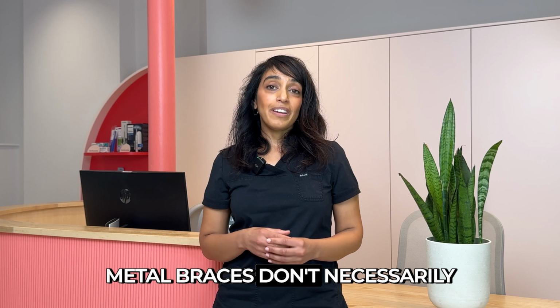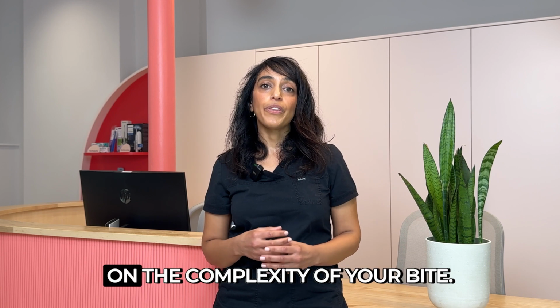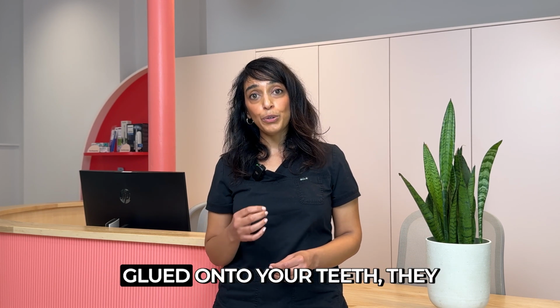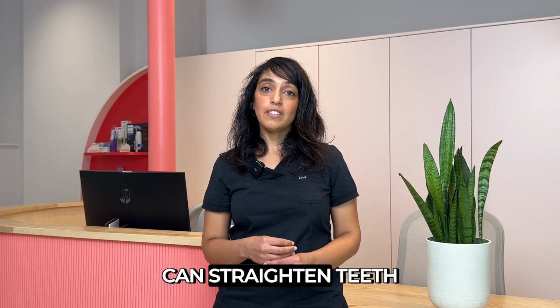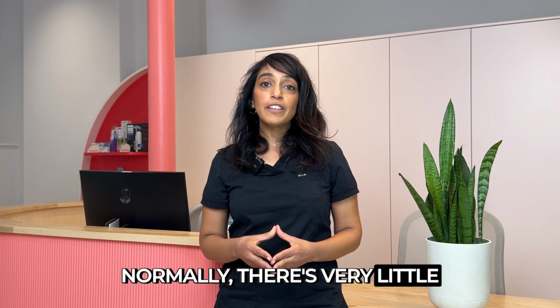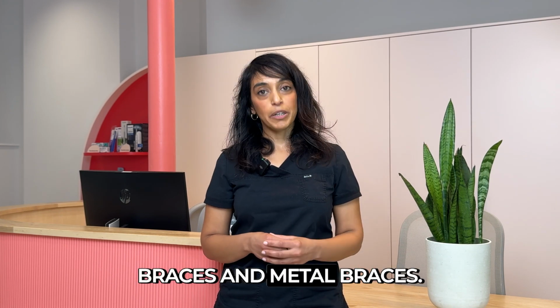Metal braces don't necessarily take any longer than other types of orthodontic appliances. However, it's highly determined by the complexity of your bite. However, as metal brackets are glued onto your teeth, they can straighten teeth in as little as 6 months. Normally, there's very little difference between the outcome of ceramic or aesthetic braces and metal braces.